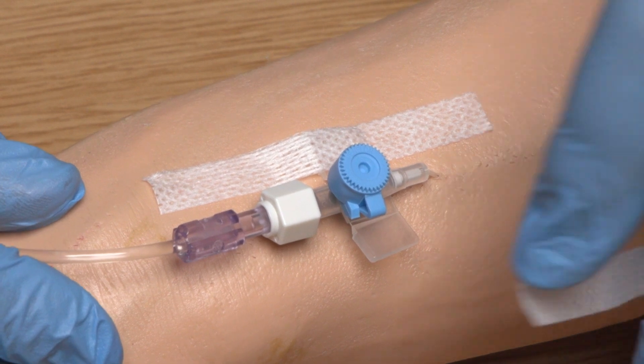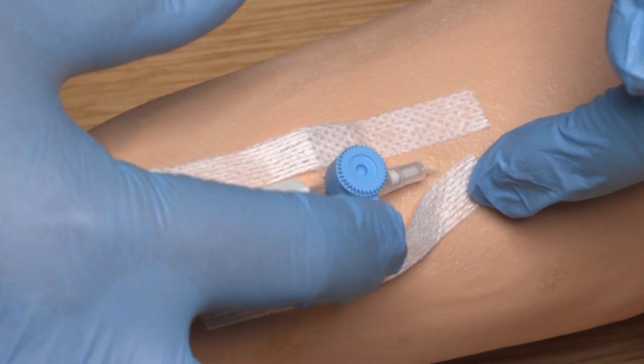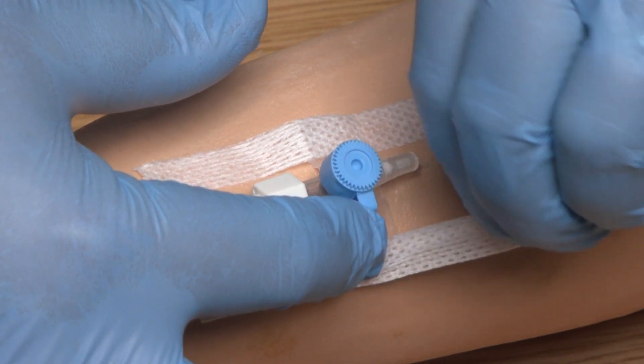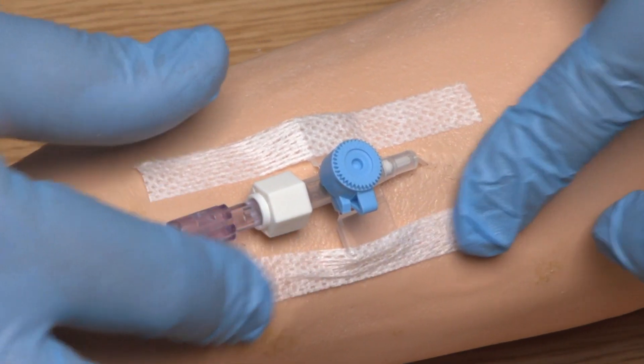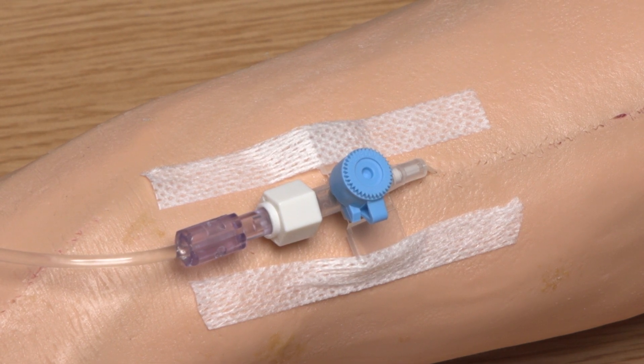The wings of the PVC need to be secured using the securing strips contained within the dressing packet. These reduce the risk of the cannula moving. The securing strips should be applied parallel to the cannula and to each other. They should not crisscross over the insertion site as this would obscure it and result in it being unable to be monitored for phlebitis and infection.